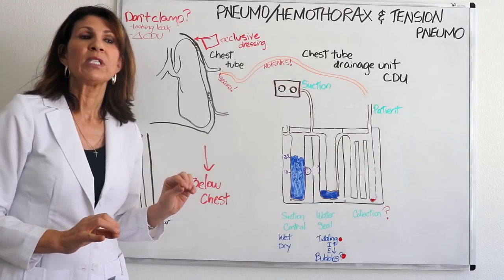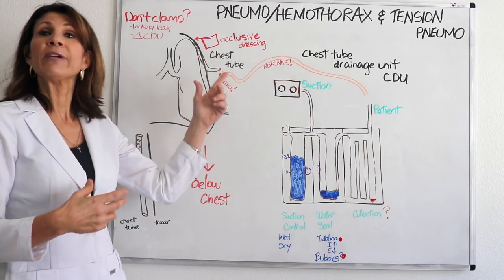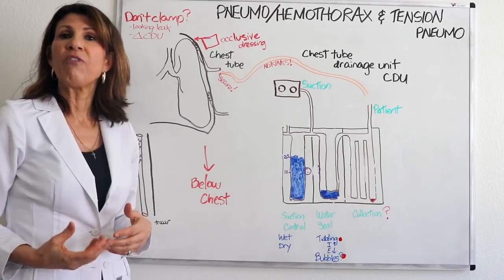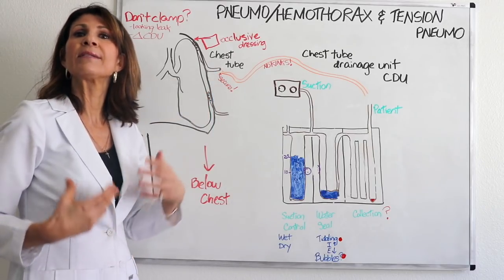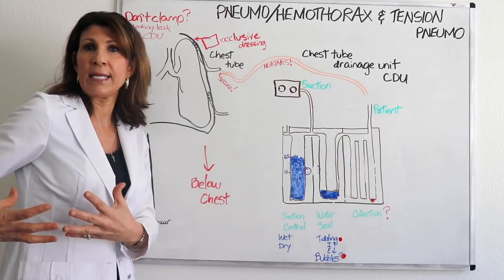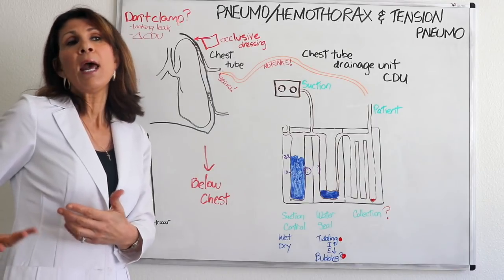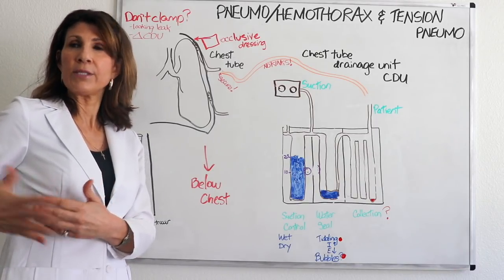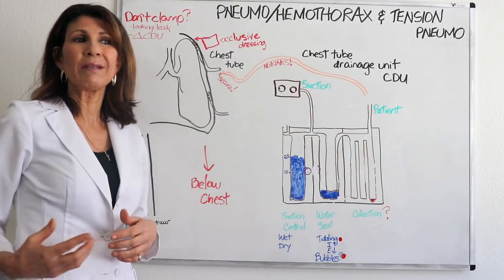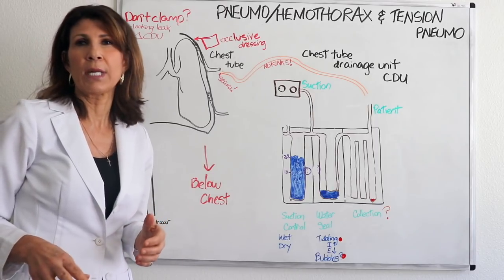Of course, this is one of those times where you have to monitor for what's called subcutaneous emphysema, which shows that indeed there is air coming through the skin that is not supposed to be. Subcu emphysema is not a normal finding, but in times when there is potential for air or there is air in the pleural space, that air may come through the skin, and that's what subcutaneous emphysema shows you, that there is air under the skin. Your implication for care is just to palpate it to verify that that's what it is and mark it. So you want to know if it is resolving. In itself, it's a benign finding, but really what it means is that you don't want air in places where it's not supposed to be.